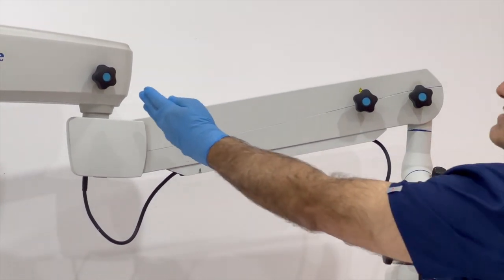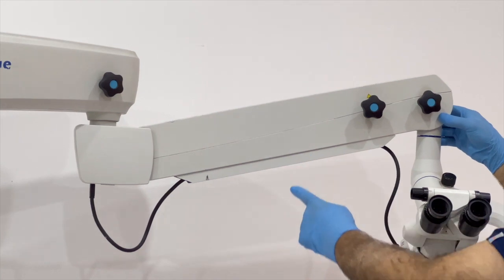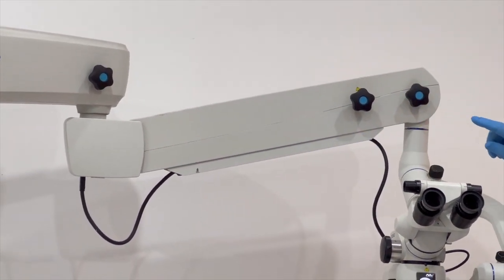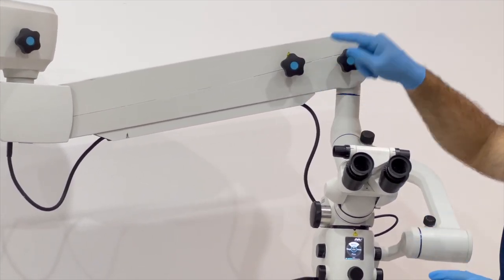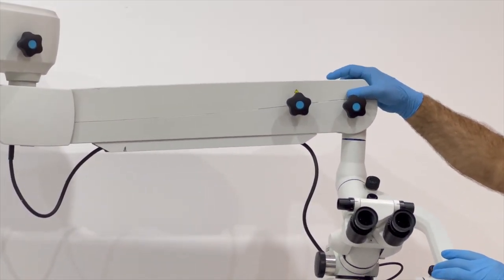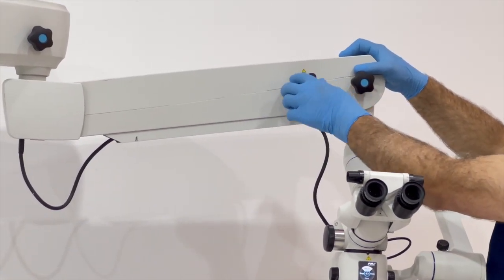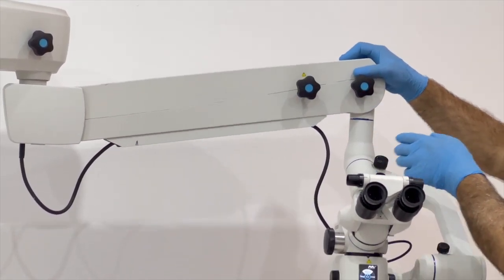But this screw, as I said again, is responsible for the horizontal movement of the secondary arm. Then this screw is responsible for tightening and loosening the vertical movement of the secondary arm. So I can lock it, or I can make it loose.